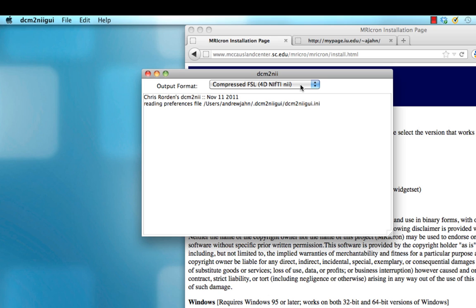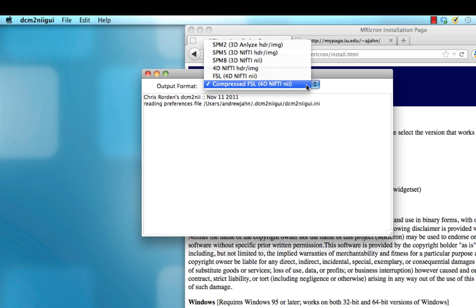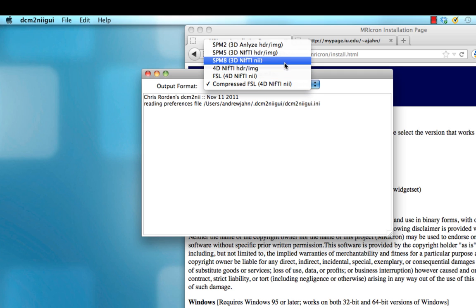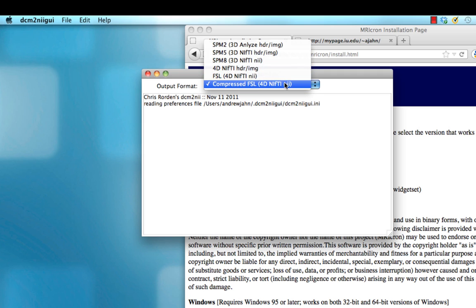The first thing to notice here is this drop-down menu, which allows you to specify the output format that you want your files in. Besides NIFTI, there's another format called header slash image, but we're going to focus on NIFTI for now.